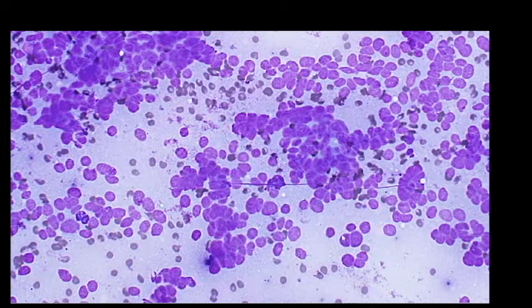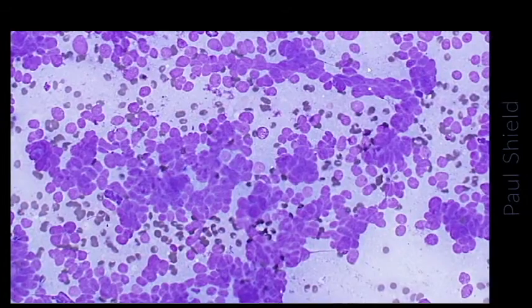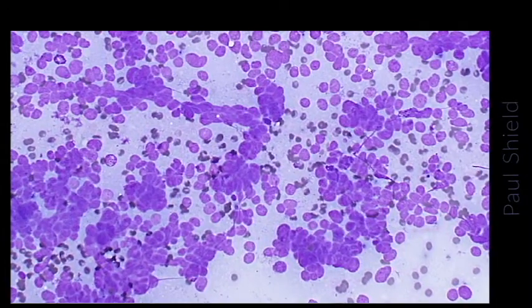You can almost make out places where nuclei meet that there is some moulding. They're sort of wrapping around each other a little. And areas like this, which are almost like linear chains of cells. So you can see the pattern's pretty similar. There are lots of these very tight little groups. I can't really see any cytoplasm yet.